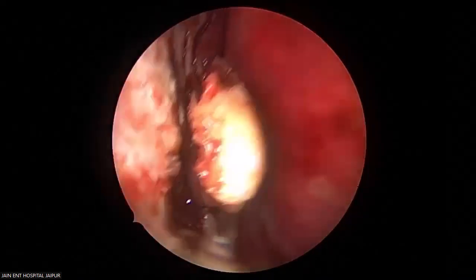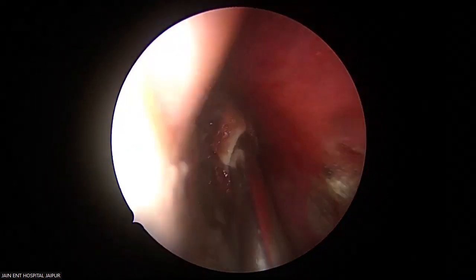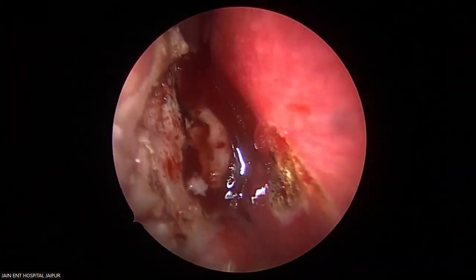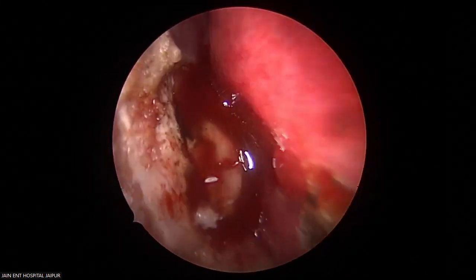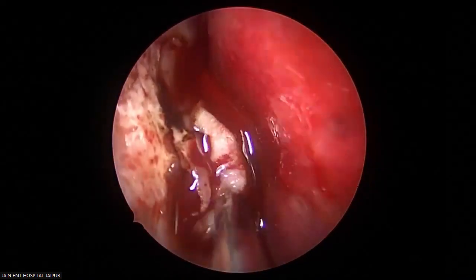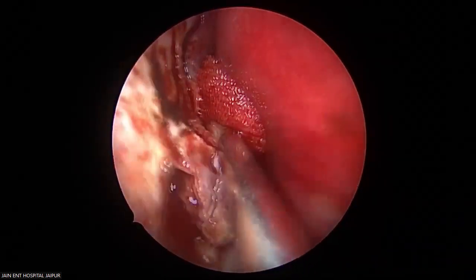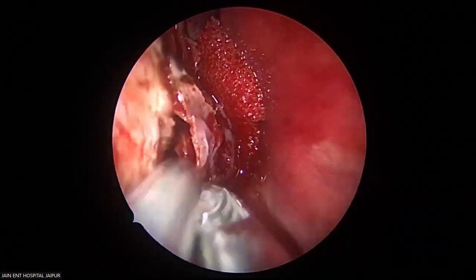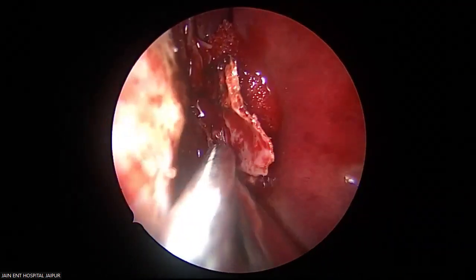Give the rider. This part of the turbinate, see this? I can take away with the micro debrider. You have to remove this inferior turbinate till the posterior wall of the maxilla. All this medial wall will go till the posterior wall of the maxilla. See, the soft tissue you can debride. The bony part you cannot simply. This is the inferior turbinate bone.